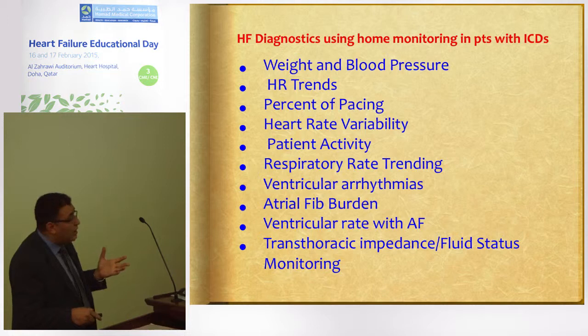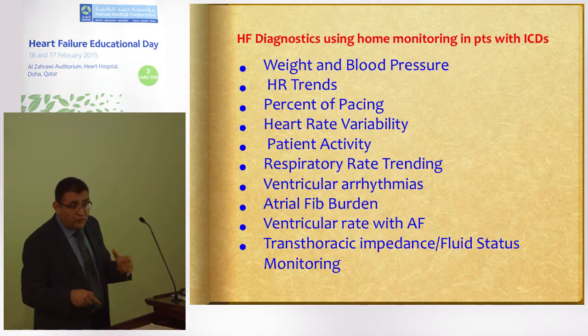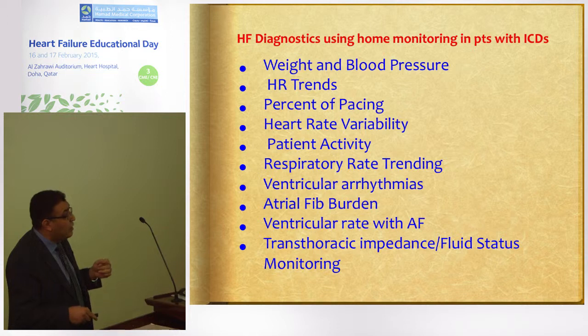Presence of ventricular arrhythmias or atrial fibrillation burden. As we know, atrial fibrillation could tip heart failure very easily into a florid heart failure. So this we could pick up from home monitoring.